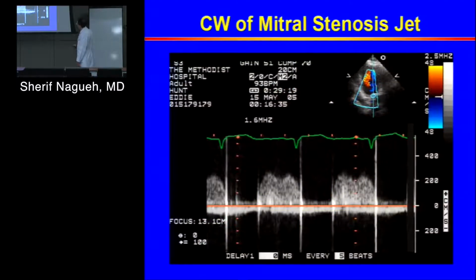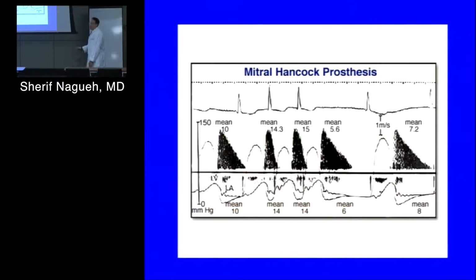A patient with mitral stenosis and pretty significant stenosis, notice the peak velocity is more than 2, and at end diastole, that velocity is still pretty high, more than 2. You can quantify this and measure it online or offline, but that simple display gives you a complete story that there is severe MS. Doppler assessment of gradients is very accurate.